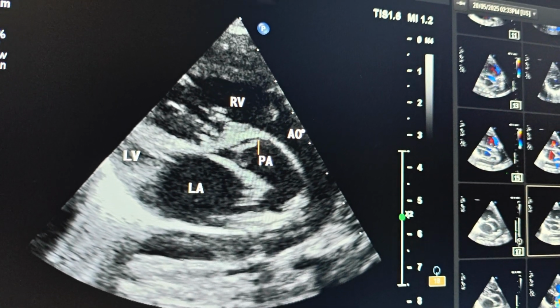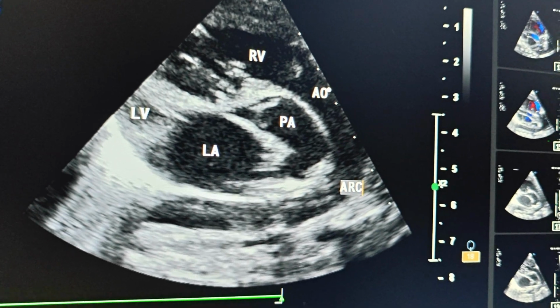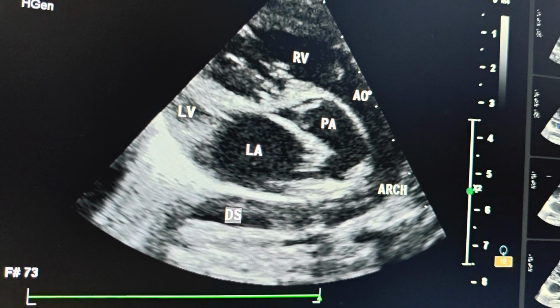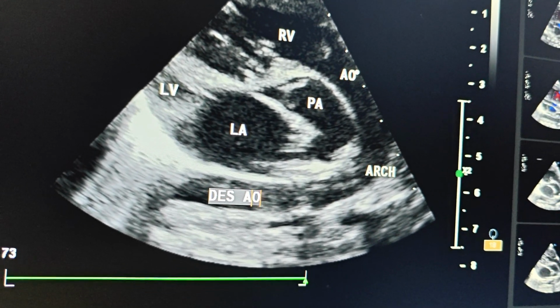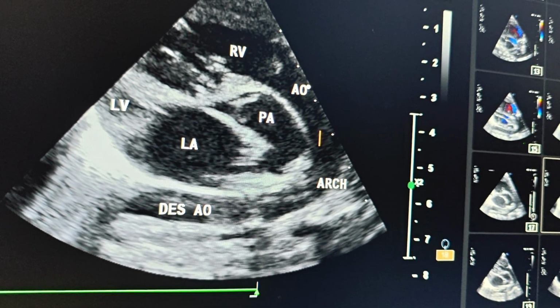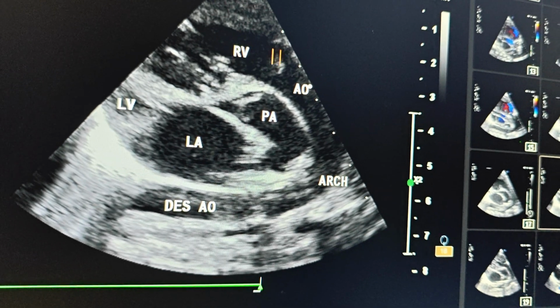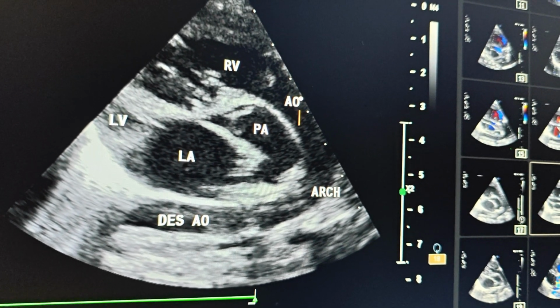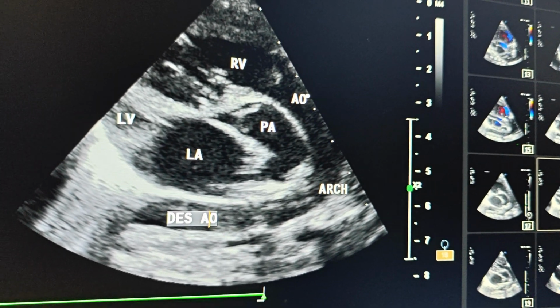What I want to show in this image: this is the aorta, this is the aortic arch, this is the arch, and this is the descending aorta. So you can see the whole aorta coming out of the right ventricle. That is the beauty of this image. This is the parasternal long axis view, and we are getting the whole aorta in a single view. This is the aorta, this is the ascending aorta, this is the arch, and this is the descending aorta.